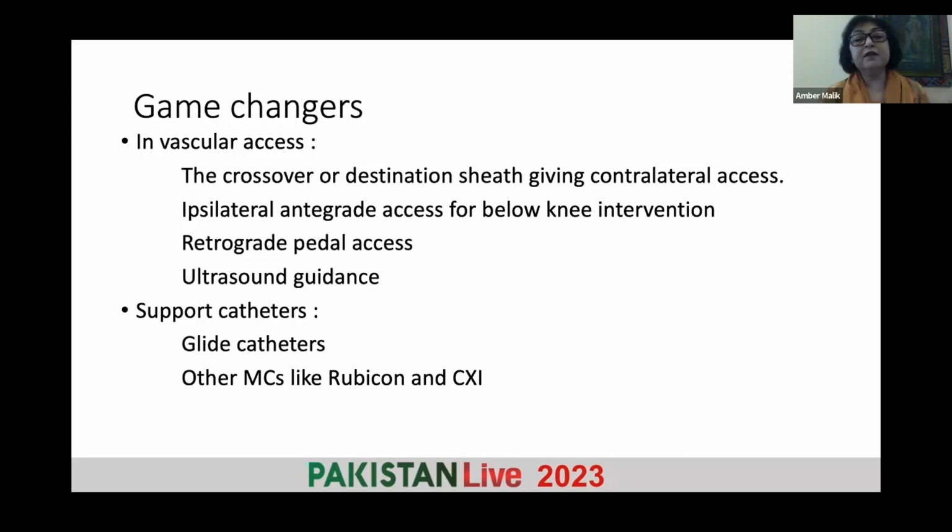When we discovered the crossover or destination sheath, which was specifically made to cross over into the contralateral artery, it acted as a guider and support, which we could never do. We used to use coronary equipment and we used to get stuck like anything. I think it is extremely important to understand, do not use coronary material for these accesses. Use dedicated sheaths and equipment, and you will have a good success.